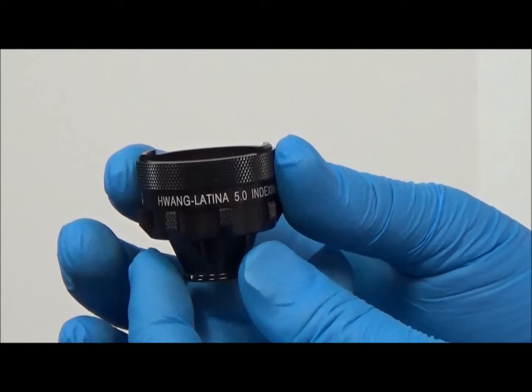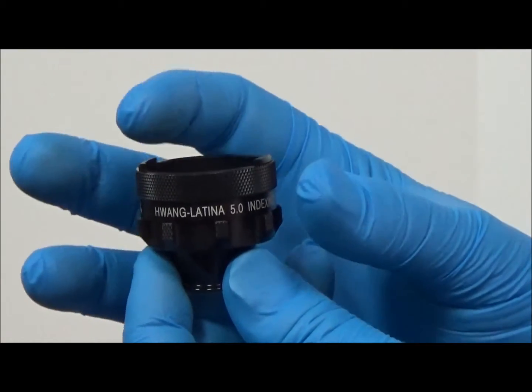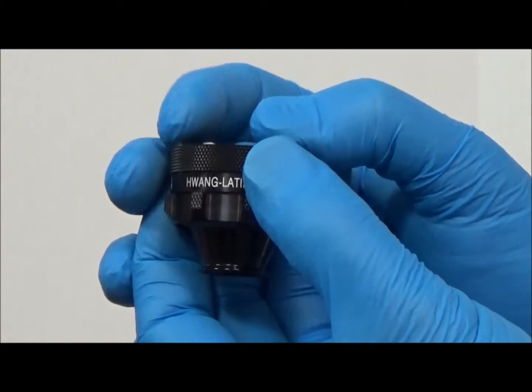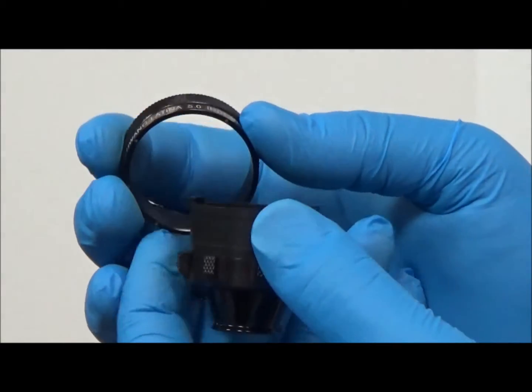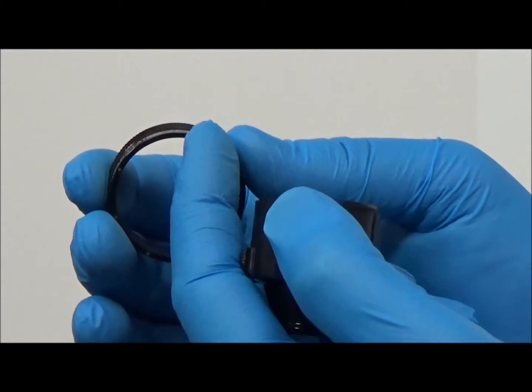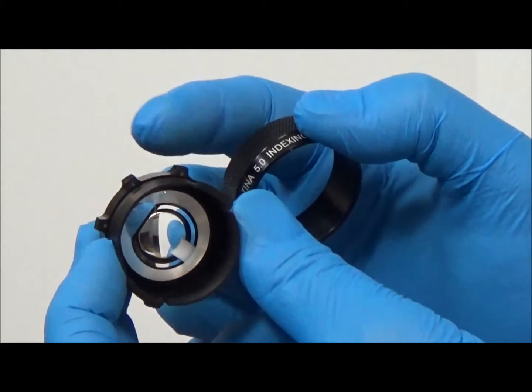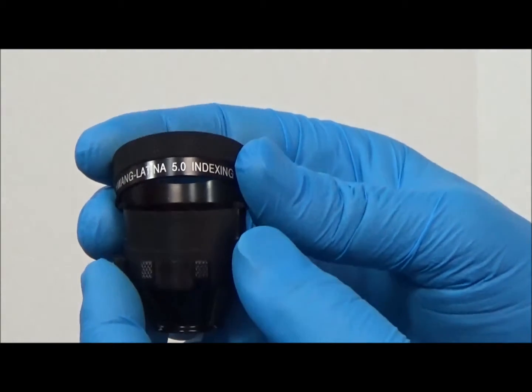Note the anterior rim is easily removed for cleaning. To disassemble, press the opposing tabs together and slide off the anterior knurled rim. With the rim removed, the indexing magnets can easily be seen. The number and position of the magnets define the rotational indexing stops, or clicks, that can be felt when rotating the lens.